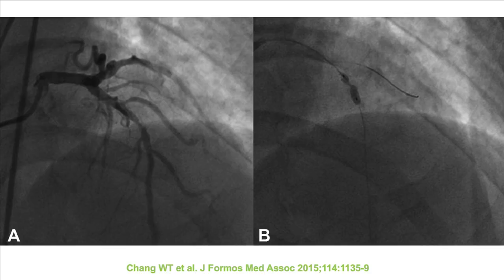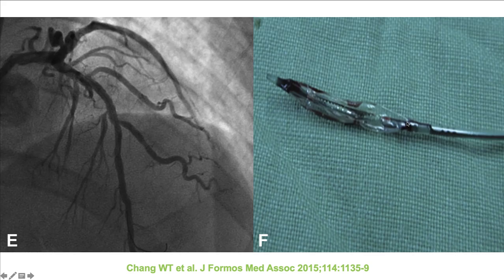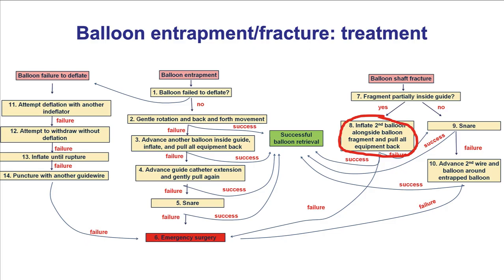Here is a case with a lesion in the mid-LAD. There was significant waisting of the balloon, the balloon ruptured, and could not be removed. The operators advanced the guide extension all the way to the entrapped balloon and were then able to remove it and successfully treat the lesion. Deep engagement with either a guide extension or the guide itself can be very helpful.